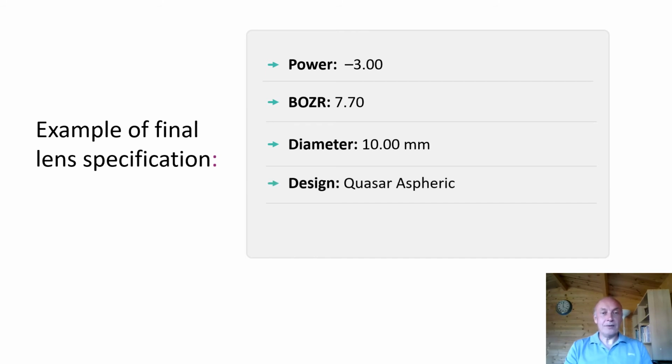We chose the Quasar design because it is a lens design that a lot of patients find very comfortable, gives great vision. And finally, we chose Optimum Extra material. Now this material has a DK of 100, which ensures that we adequately oxygenate the cornea to prevent any kind of hypoxia, even with long wearing times. We specified a blue tint. Now this is a pure visibility tint, does nothing to the patient's eye colour. It's just to help them see the lens when it's in the case, particularly if they're highly ametropic.